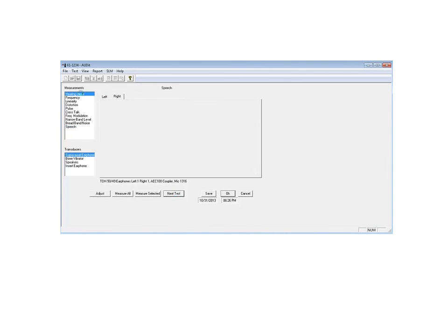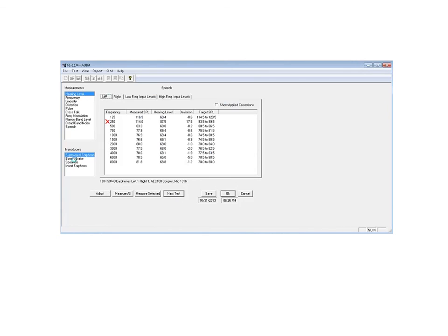Okay, that's our hearing level with a supraoral earphone.